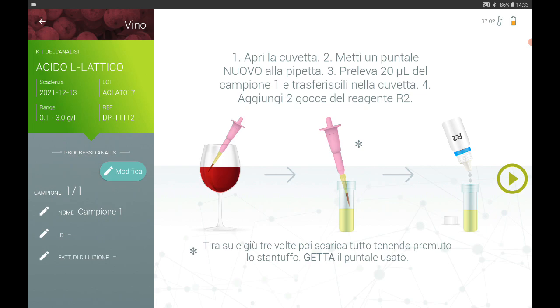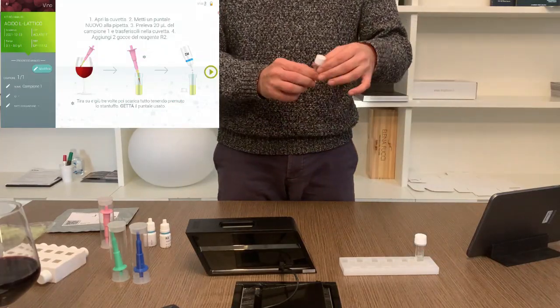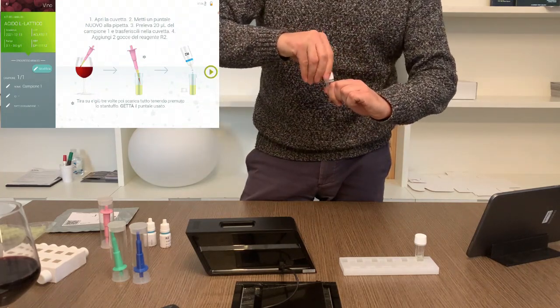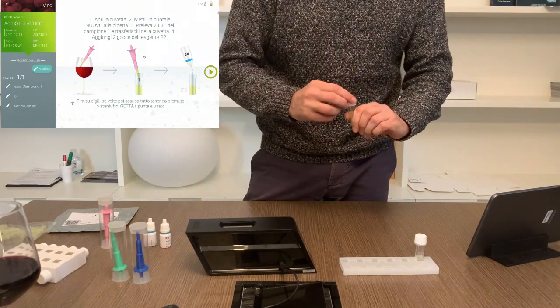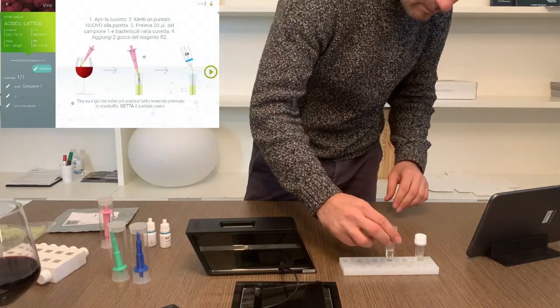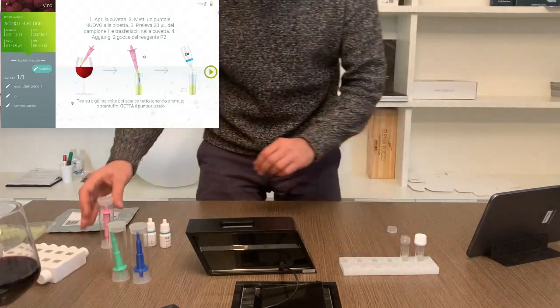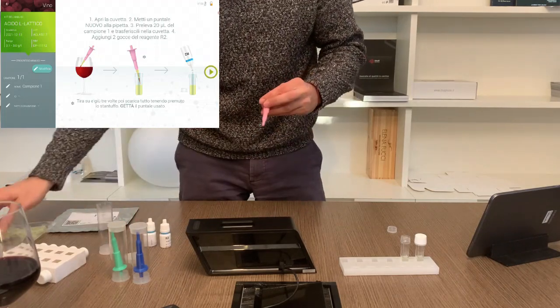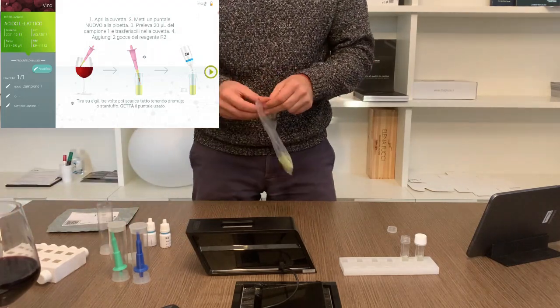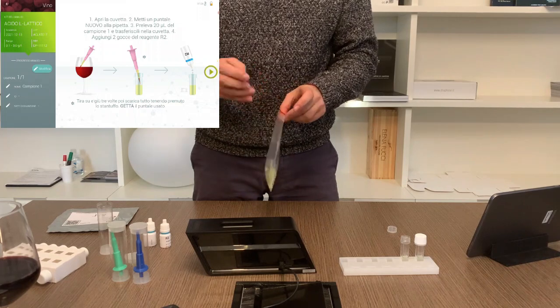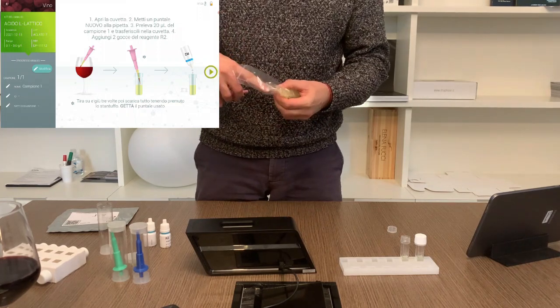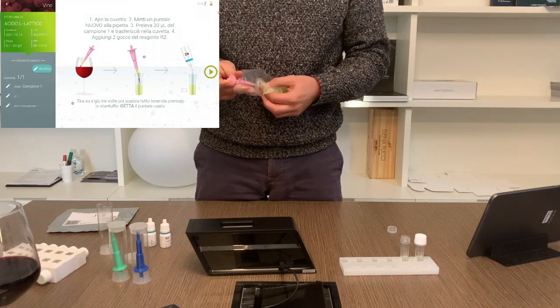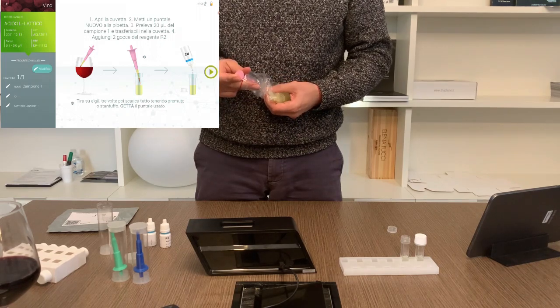We now come to the first manual step required, so follow the steps indicated by the app in the same order in which they are proposed. Open the cuvette, making sure to touch it from the sides with the knurling and not from the smooth side. Take a yellow disposable pipette tip without touching the tip with your fingers and insert it into the pipette of the color required by the app. Pipettes have a fixed volume so they do not need to be adjusted.